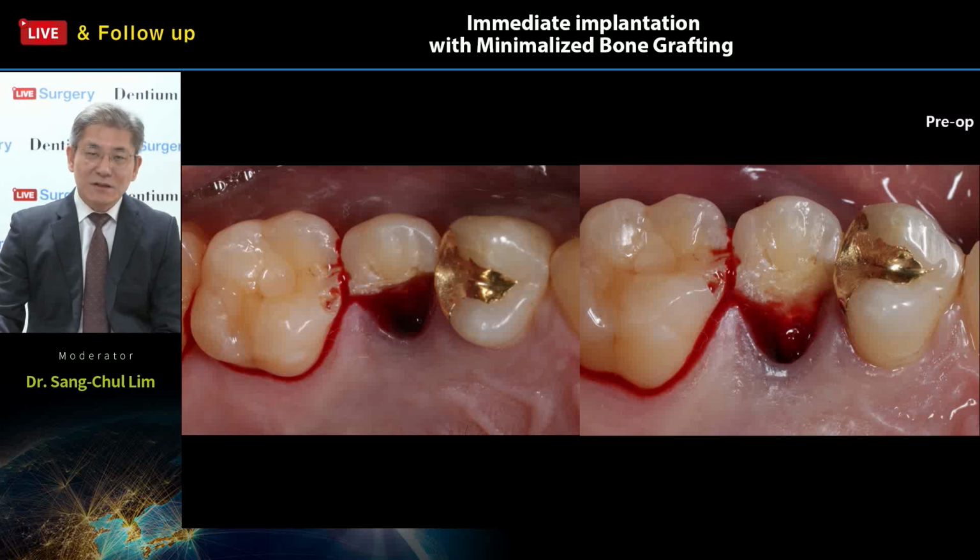When we have this kind of fractured tooth in our patient, we have to consider which option is better for the patient and for me. First of all, the fracture line is a very important factor to consider. With a slightly oblique fracture line, the fractured tooth is more likely to survive, as you know.